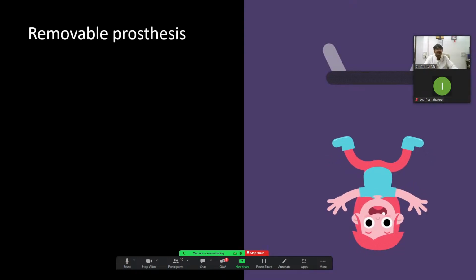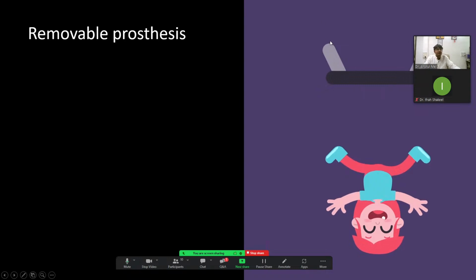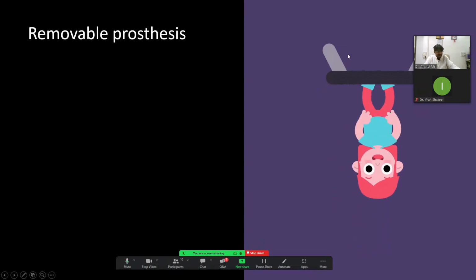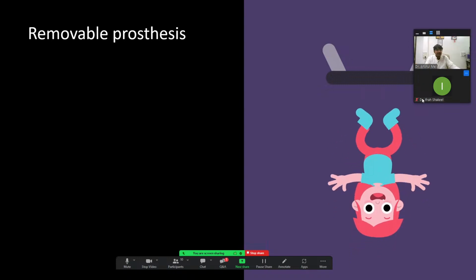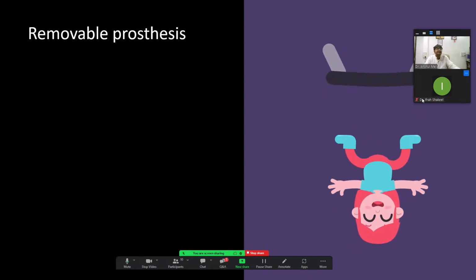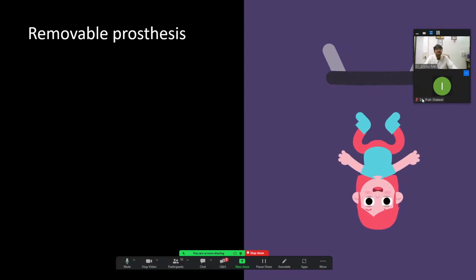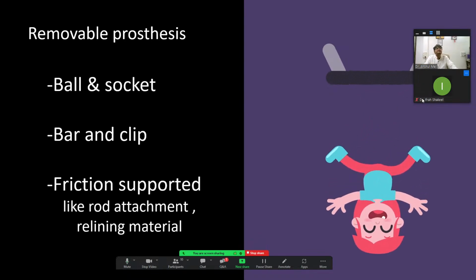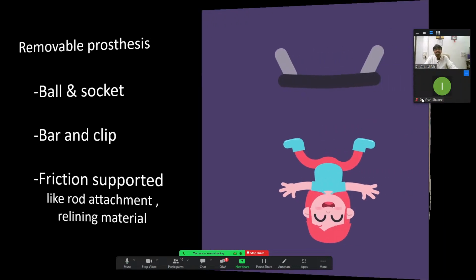Okay, so if every day the patient is wearing or treating the denture, it has a lot of forces. As you can see on the table, the table base and the pillars move when taking out the denture. In the same way, a zygomatic implant also transfers the forces, and that's the reason it fails in most cases, even after healing.